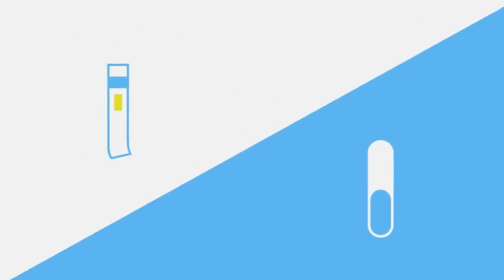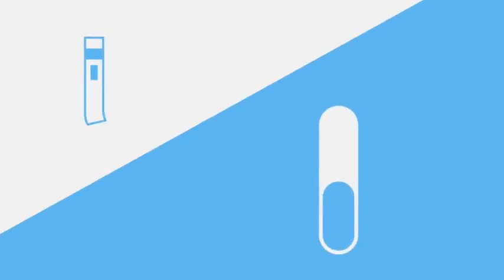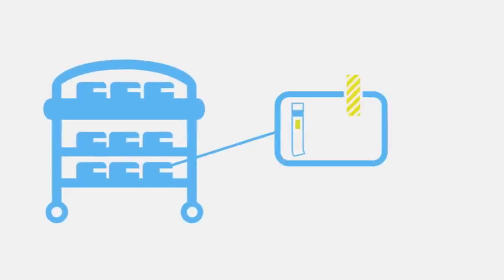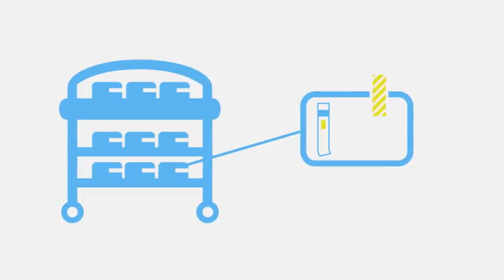CIs utilize either reactive ink technology, better known as color change indicators, or tablet technology, in which a chemical melts in response to steam and temperature and wicks down a paper path, better known as moving front technology. Internal CIs are used to verify that the steam has penetrated deep inside the pack or container. External CIs are placed on each pack or tray to distinguish processed from unprocessed load items.